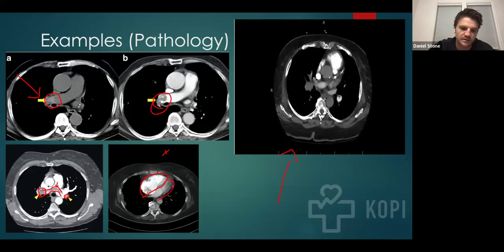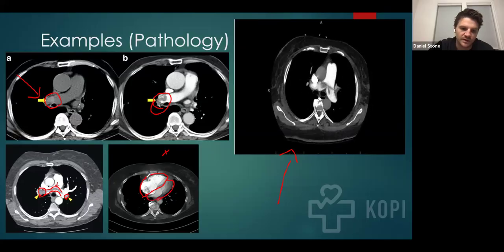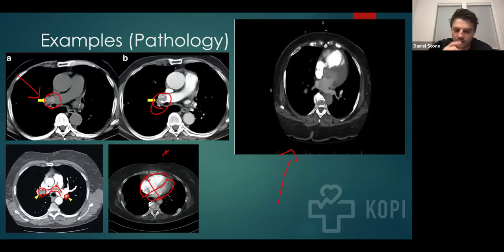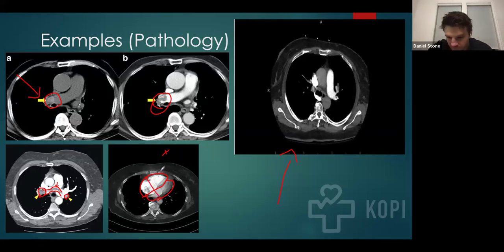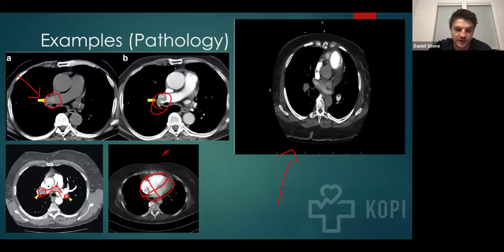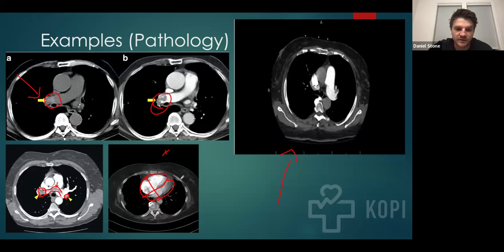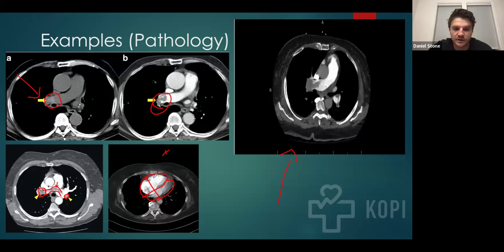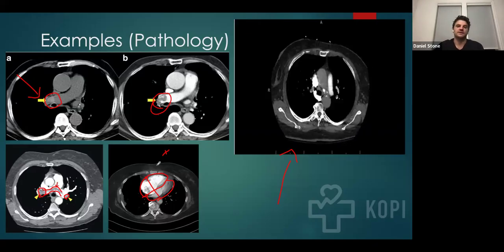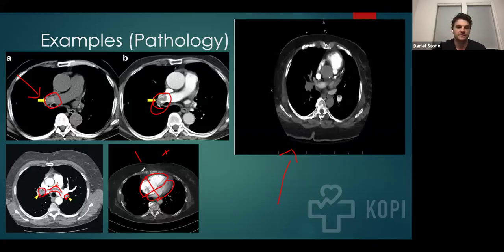And so when you're talking about how big the ventricle should be, you want to take it from the tricuspid valve and then measure across to the mitral valve. Anything above a 50-50 ratio in the right heart is suggestive of right heart strain. And you usually do this with an axial view. So this is a good example of what right heart strain is.